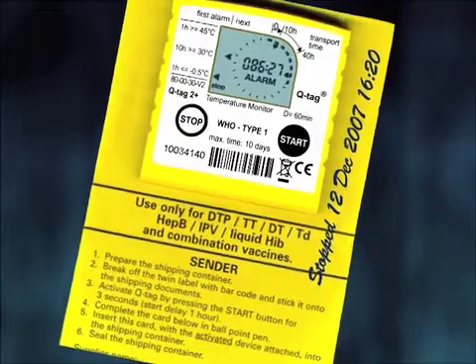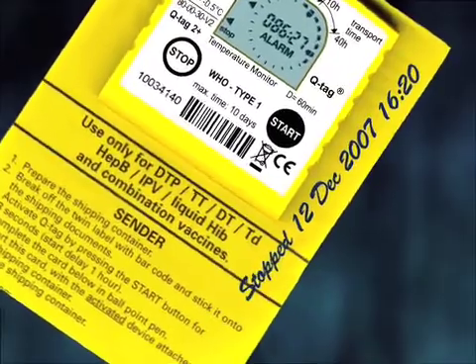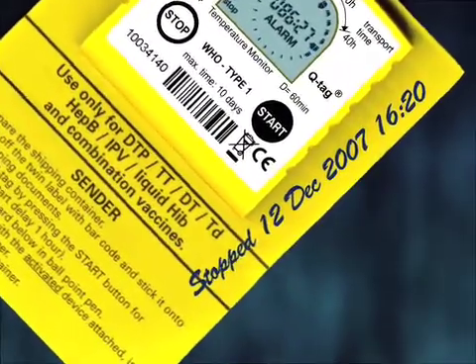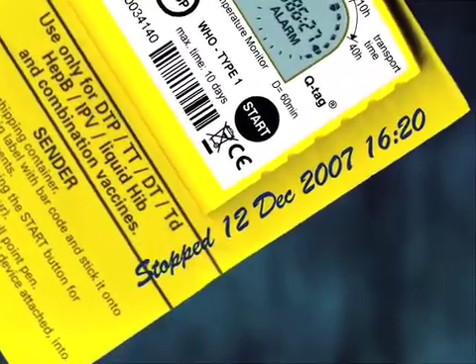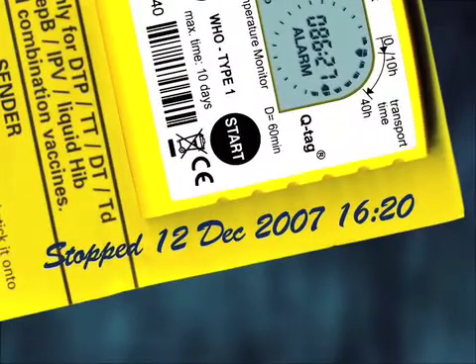If there are any alarms, you must write down the date and local time you stopped the device on the backing card. This is important when you refer to the device after you have stopped it, as it will help you calculate the precise time of the violation.